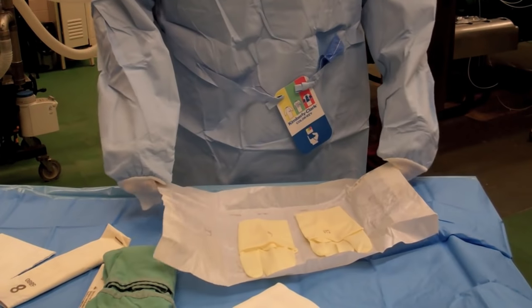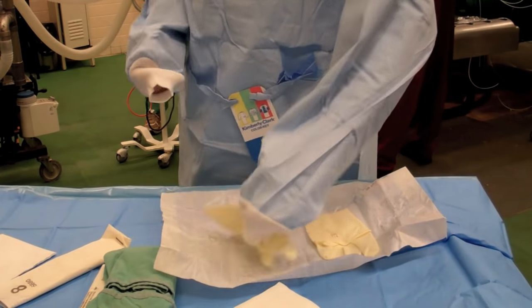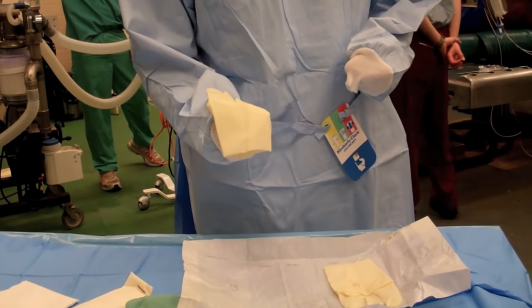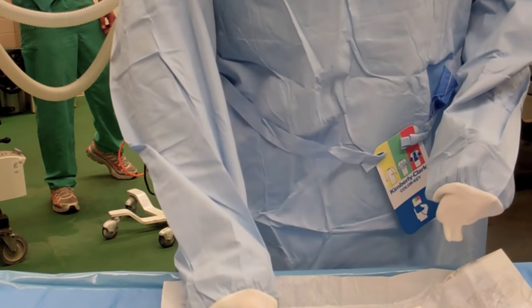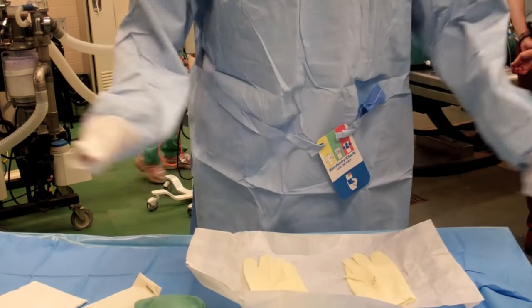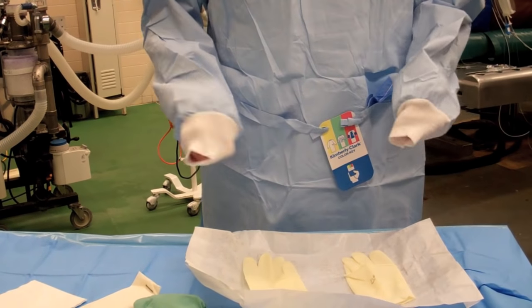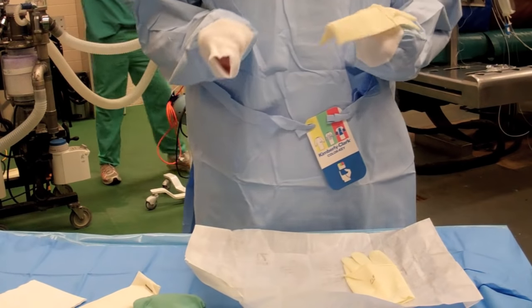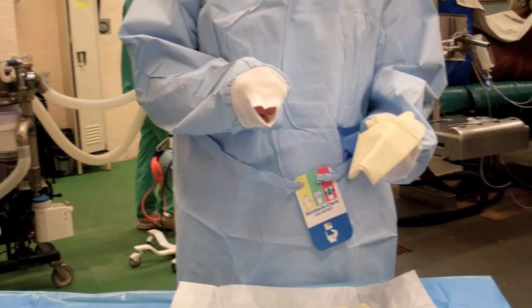Now, if I open the glove pack with the correct side so the right glove is on my right side, I've got to take the glove and put it thumb to thumb. So I've got my right glove, my right thumb to my right thumb. I open my glove packs upside down, and so now my left glove is on my right side — I just grab it and it's already thumb to thumb.